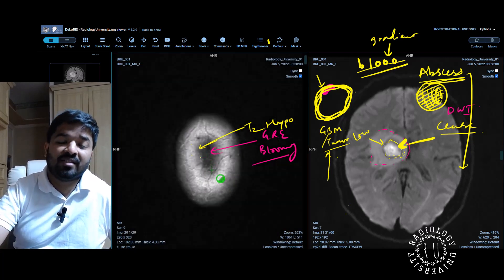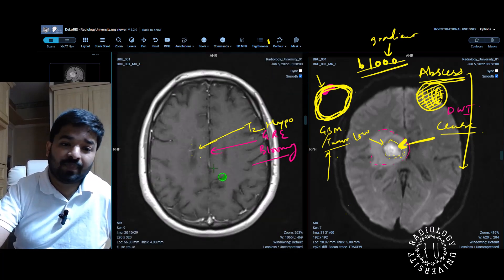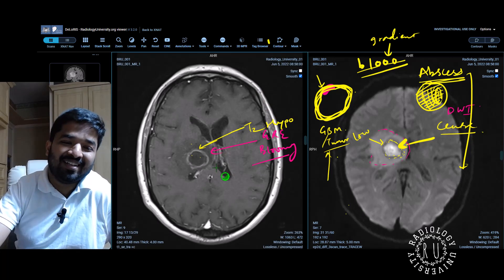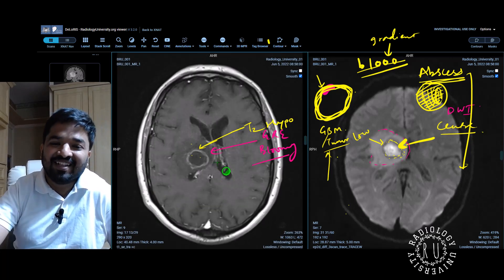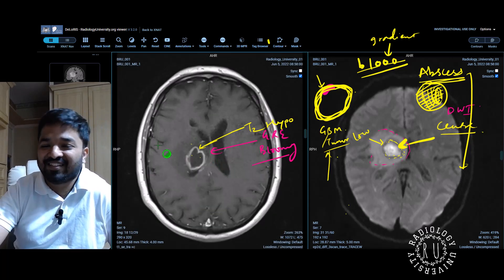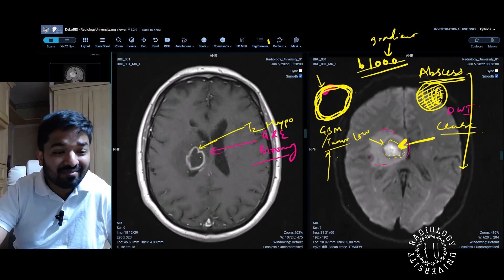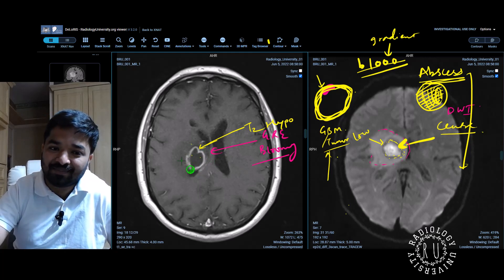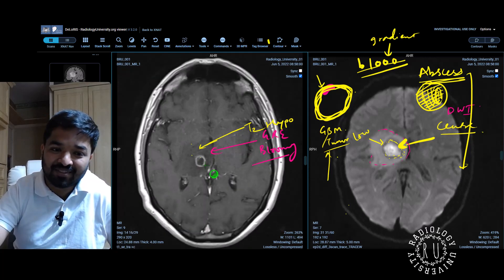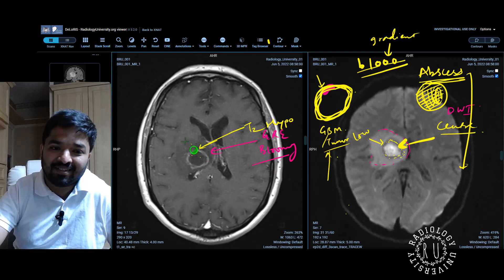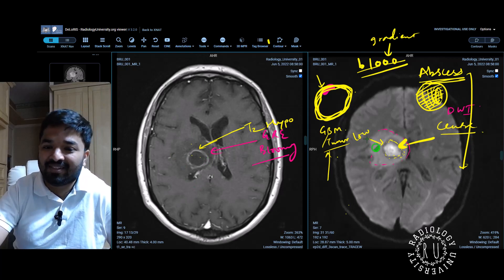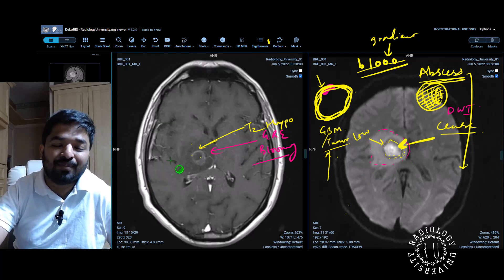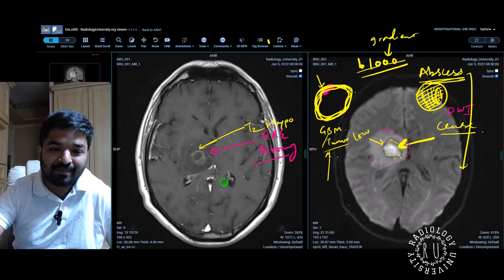This is your favorite sequence which everyone wants to see — contrast. And as you would have expected, there is rim enhancement around the lesion, and surrounding that there is edema which is T1 hypointense. So that's an abscess.